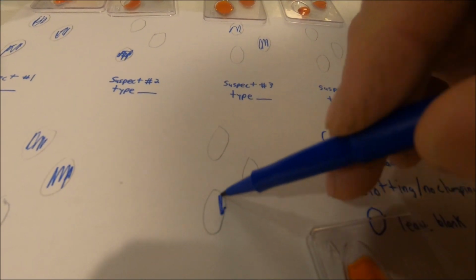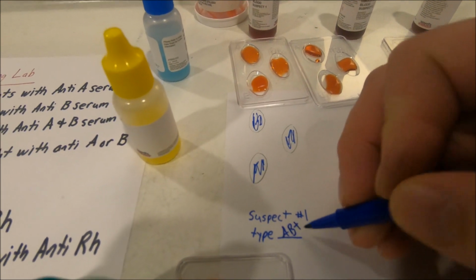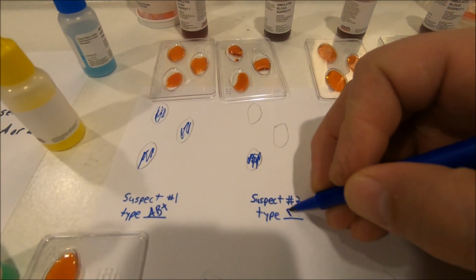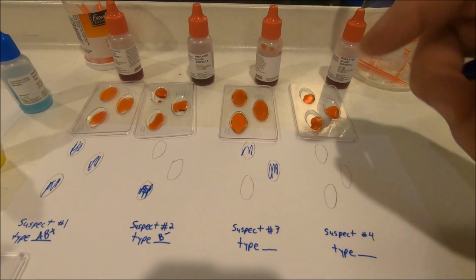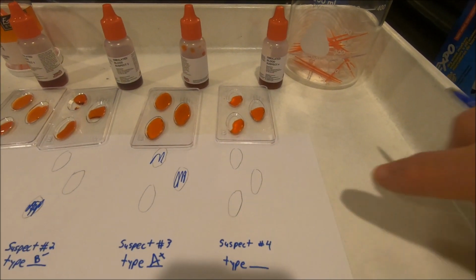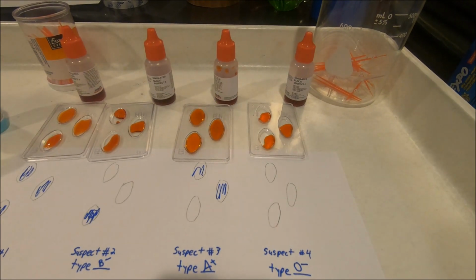Now to compare blood types. Suspect 1 has the A, the B, and the positive, so we are going to say that they are AB positive. Suspect 2 only has the B blood, so B, no RH, so B negative. Suspect 3 clotted with the A, clotted with the RH, so it's going to have A positive blood. Suspect 4 did not clot with either the A or the B or the RH, so it has O blood, and not clotting with the RH, O negative.